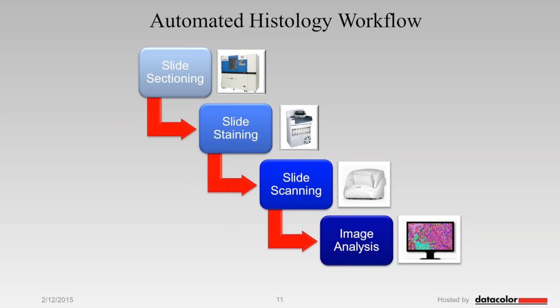For lack of a better word, they're really black boxes where you put the physical slide in on one end, and then you have to trust that the digital slide that comes out on the other end is really an accurate representation of what's going on in the tissue. But can you be sure about this? So this is what my presentation is focused on today.